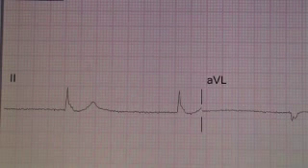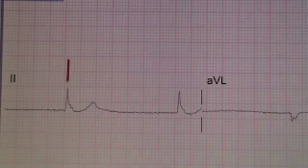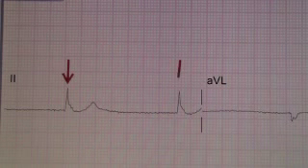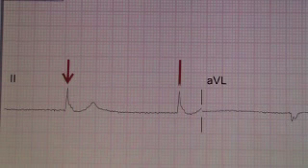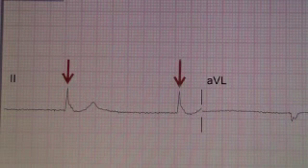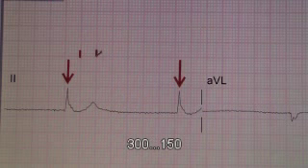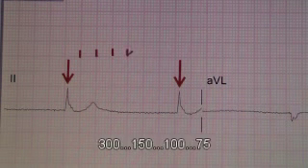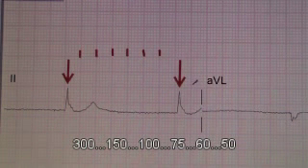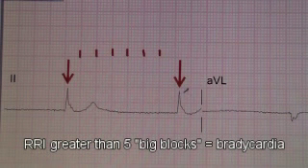This patient has a pretty slow bradycardic rhythm. Find one of these complexes that falls relatively close to one of the 5 millimeter lines, and this one's pretty close. They don't have to be exact. The next complex is way over here. By now it should become apparent that this patient's pretty bradycardic because of this extensively long R to R interval. When we count across on this R to R interval, we find that we get 300, 150, 100, 75, 60, 50. Well, the next QRS complex is way beyond that, so you know that this patient's heart rate is below 50. This patient's pretty bradycardic.